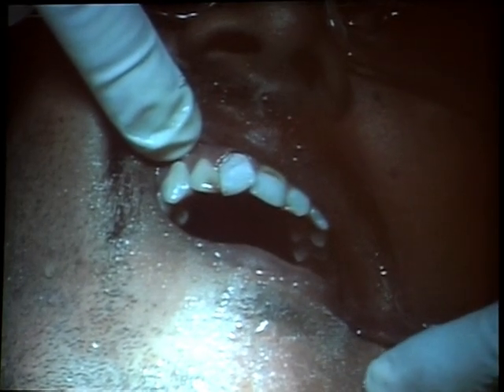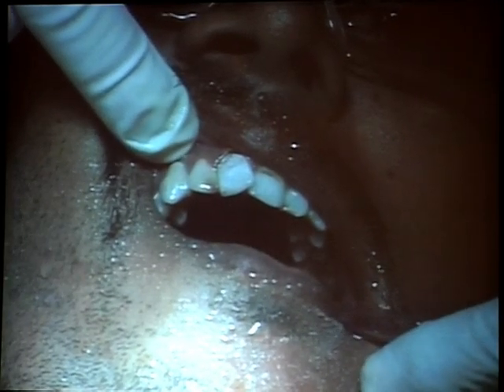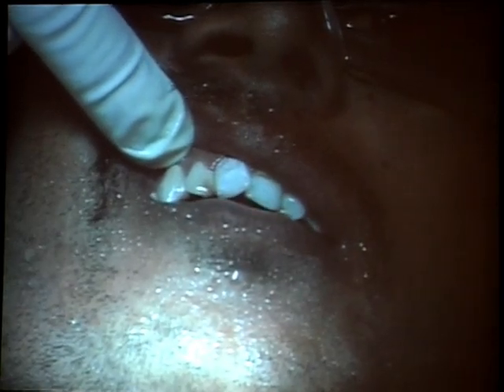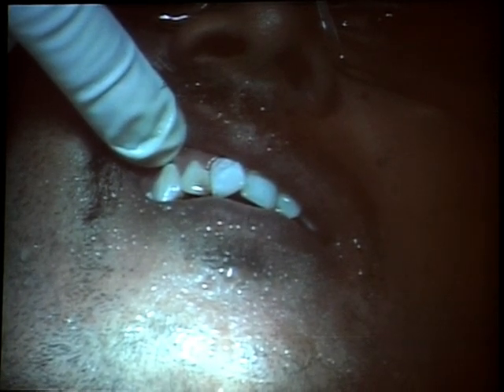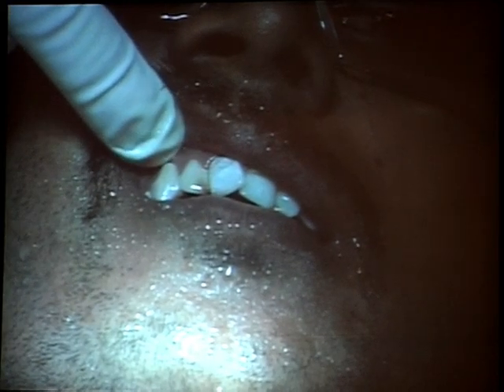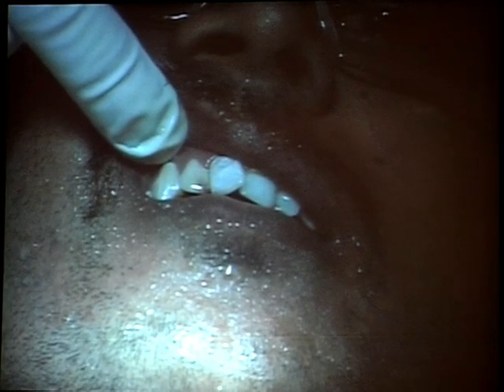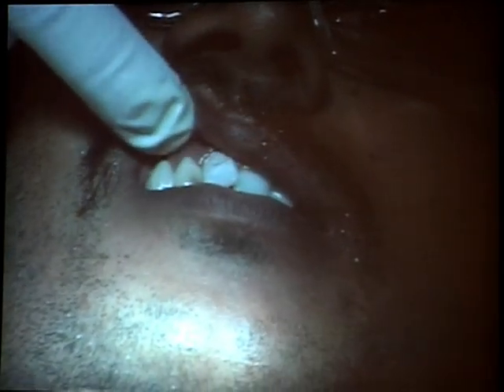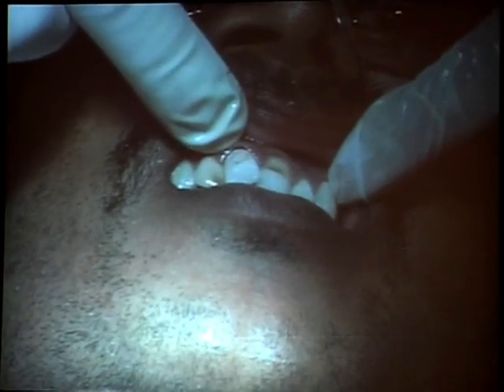So the water on top expands, and the interstitial tissues, which are organic in nature, are absorbing the laser beam and they are expanding and they are actually expelling out the hydroxyapatite crystal. So therefore, we are not interfering with the dentinal tubular fluid at all. Absolutely. You get a nice shower additionally. In fact, there's a rehydrating effect because there's a lot of water there.